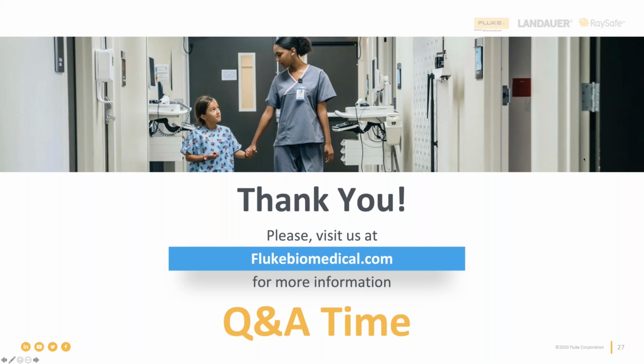You really want to make sure that it works for any and all patients in any and all conditions. And that's why you're testing all these different heart rates, to make sure that the patient monitor is reacting in the way that it should. Because if you miss an alarm and it's not detecting something that it should, that can have really adverse effects on the patient.